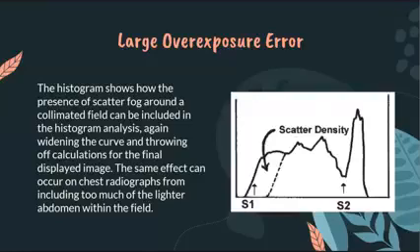Okay? In all of these cases, inclusion of the lighter densities causes computer to rescale the displayed image to dark. Okay? So, yun nga, if there is an inclusion of lighter densities, it will produce an image that is too dark, overexposed pala, sorry, not underexposed. No, it will provide an image that is too dark, not too light, not underexposed, but overexposed po siya because there's overexposure error nga, di ba? Okay?